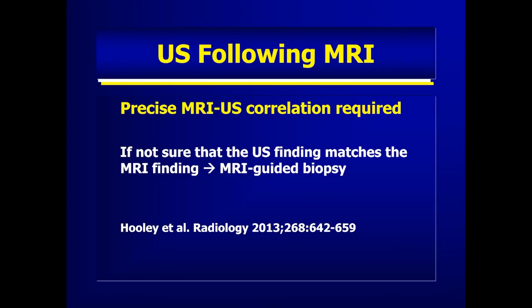So we want precise MRI ultrasound correlation. If we're not sure that the finding on ultrasound may match, or we're not sure if it fits with the MRI finding, then we should go to MRI-guided biopsy if the lesion was thought to be suspicious on MRI.